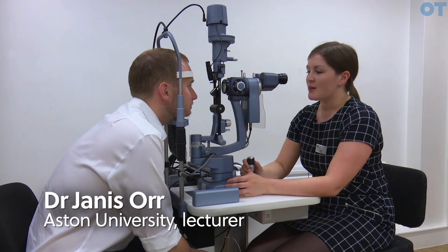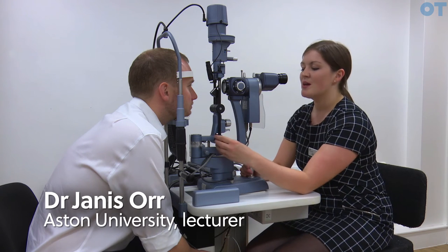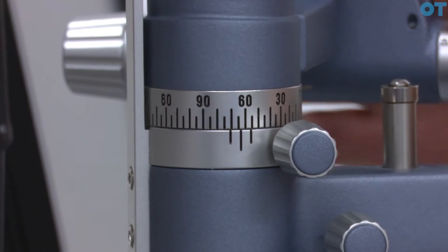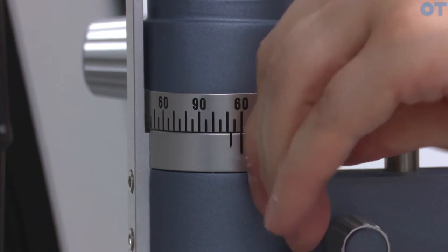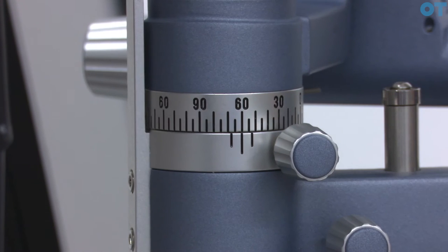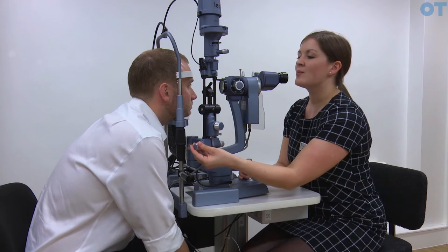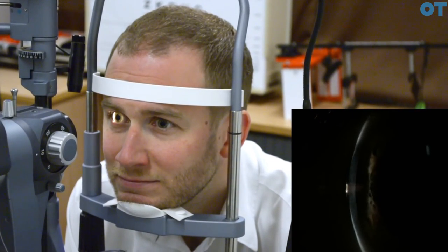One method that allows you to check the depth of the anterior chamber is Van Herrick's technique. In order to perform Van Herrick's, the observation and illumination systems have to be separated by exactly 60 degrees and locked into place. Use a narrow beam placed exactly at the limbus, and essentially you are comparing the thickness of the section of the cornea with the dark band of anterior chamber exactly adjacent to it.